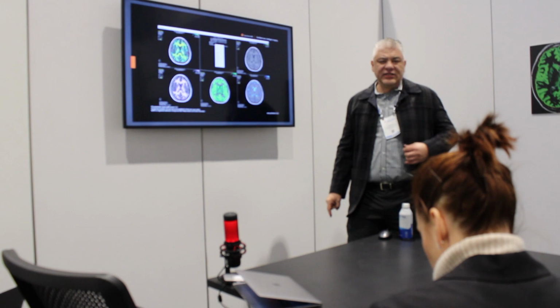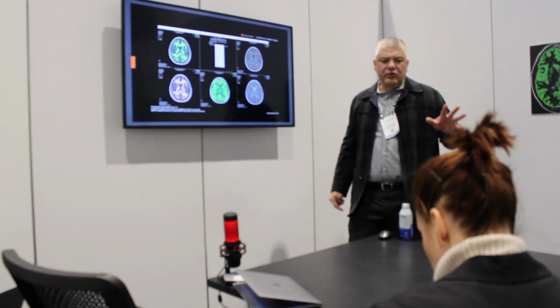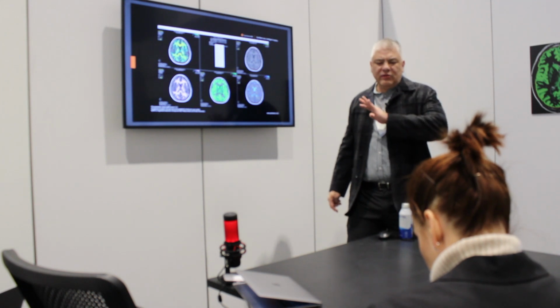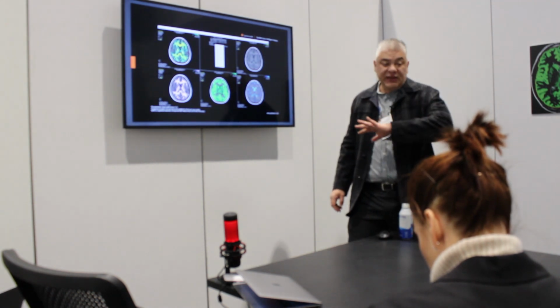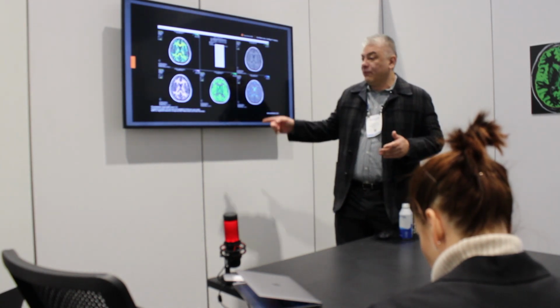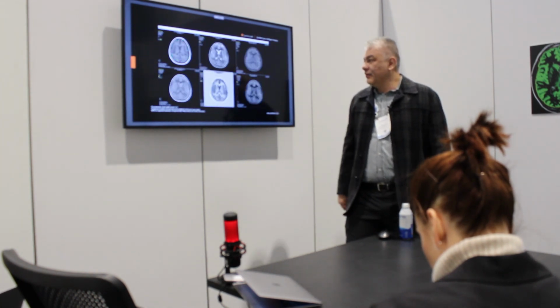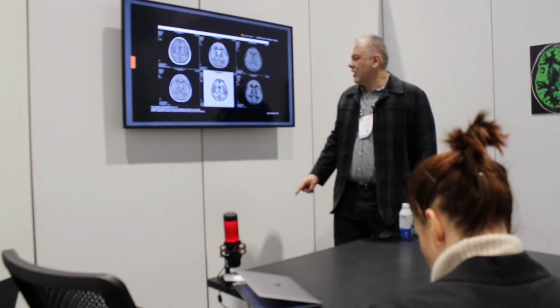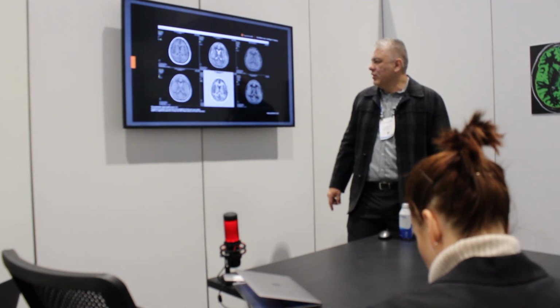You can tell the system, I want you to send me these maps and these echoes. All that can be pre-programmed and then sent later, or sent at the same time that the study is done. Or you can open the portal yourself and play with it, like I like to do. Next. And there are all the different echoes. I particularly like the PSIR and the double IR. They're very useful. I'm going to show you.